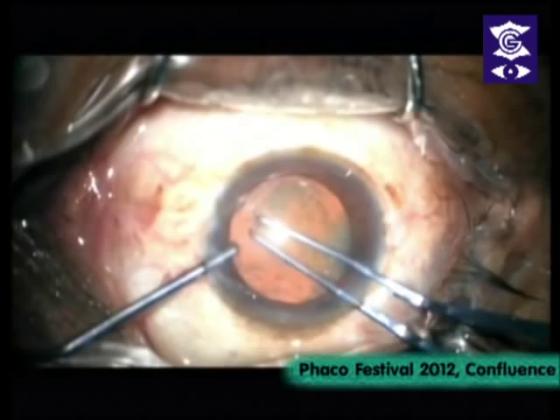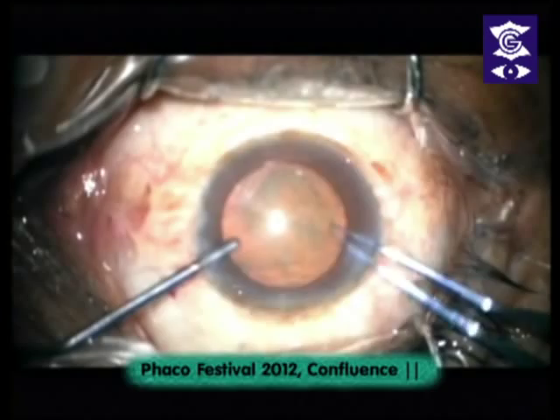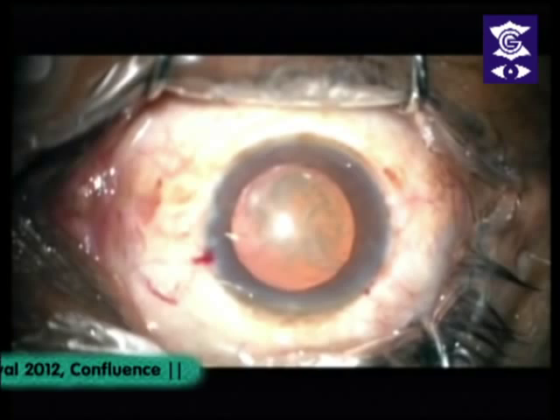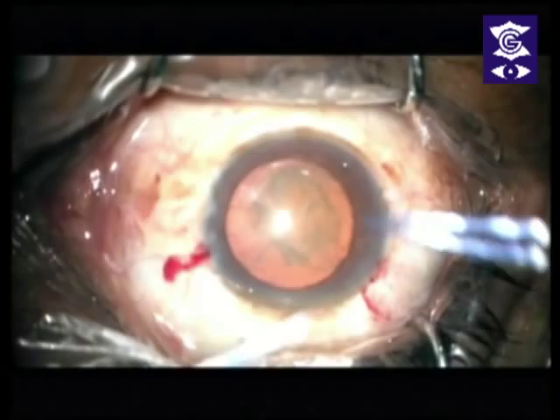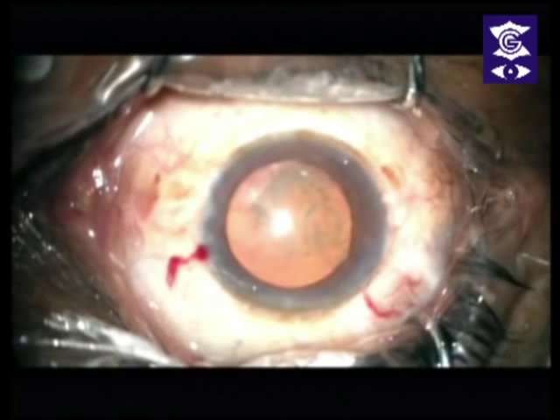Next step is to do a nice rexis. This lens is a plate haptic lens from Zeiss, so I would like to make about a 6mm rexis. Notice the rexis has run away. What do you do at this stage? Put some viscoelastic. This is going to happen to all of us sometime or other, however well practiced we are. Put viscoelastic where the rexis has tried to run away and simply pull it back in. If your rexis tries to run away, it's not such a big deal anymore.